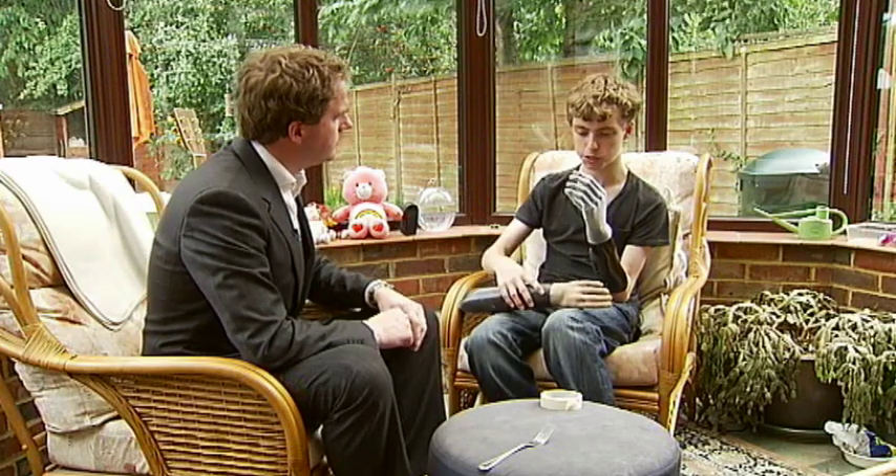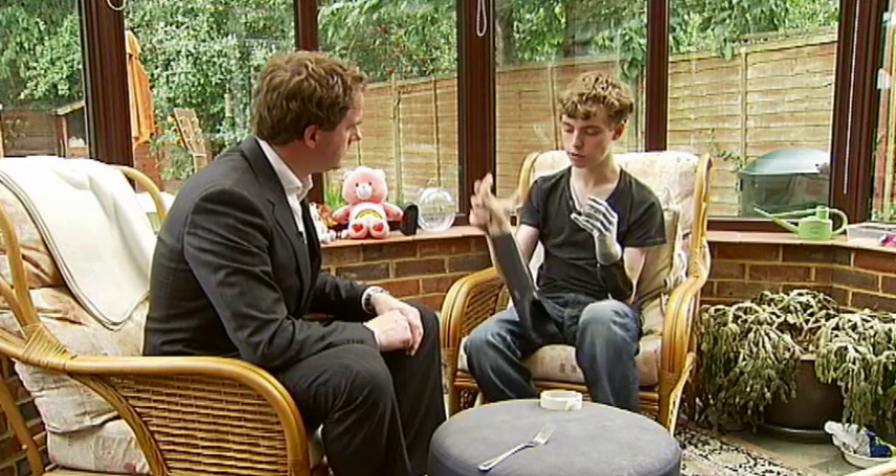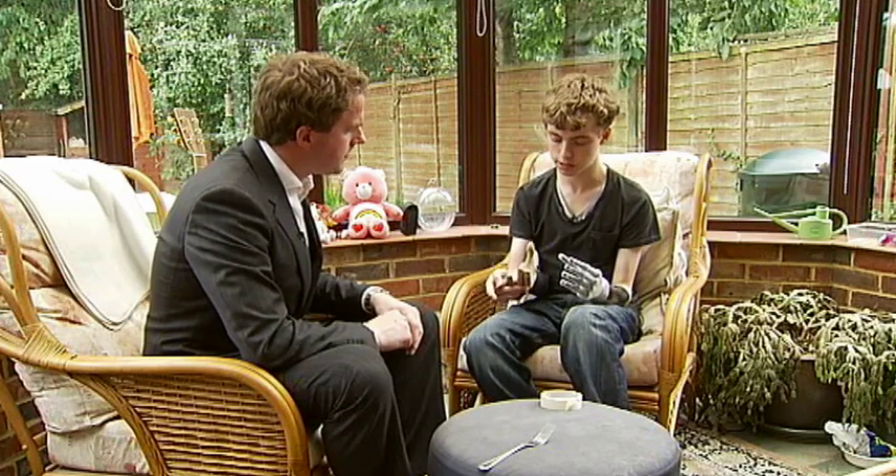This new hand is much more advanced. Each finger is individually powered, whereas with this hand, only these two fingers are powered, and these two are just rubber.